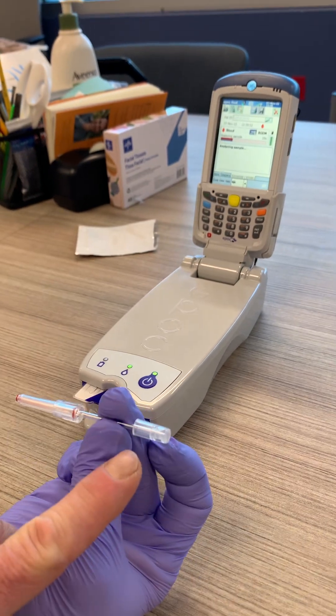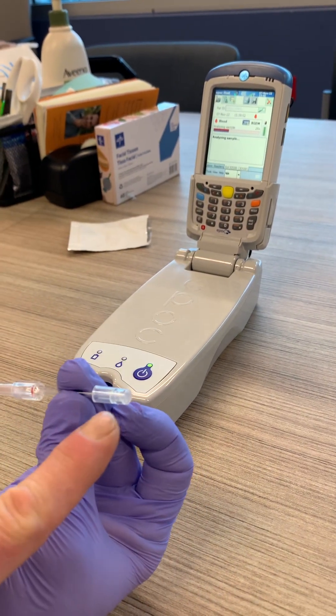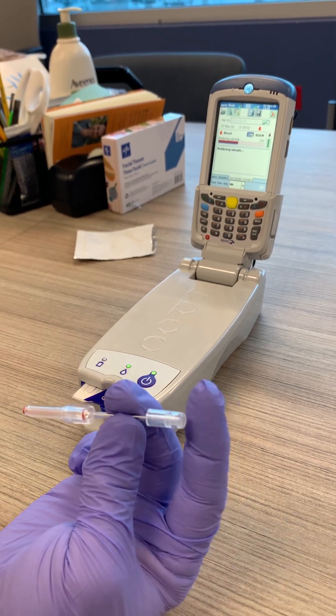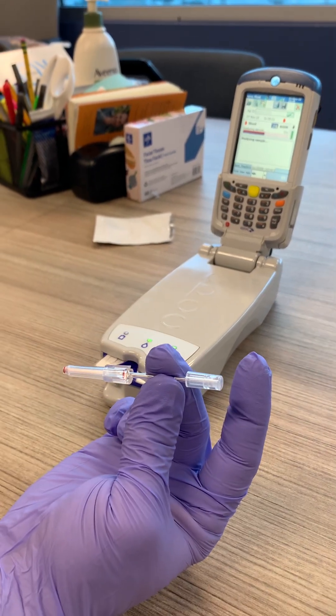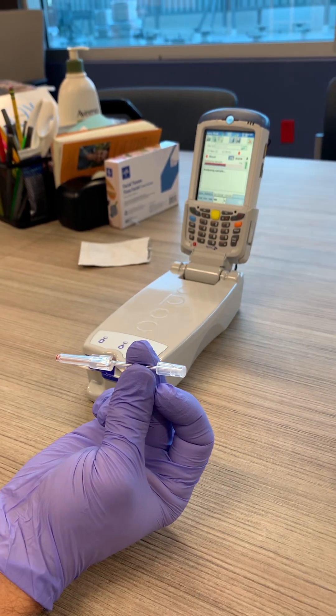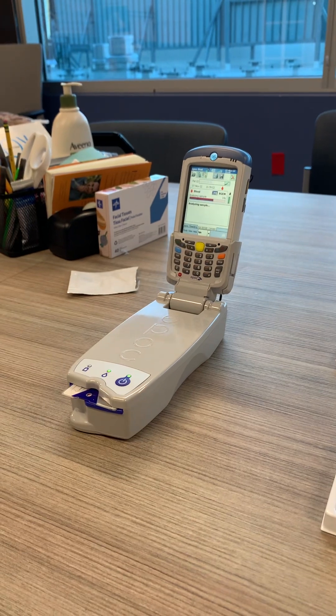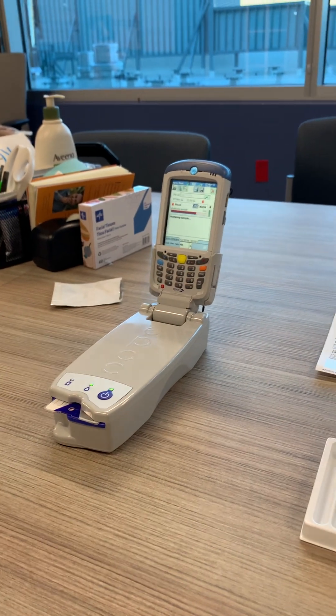If you look at the plunger here, you can see it has now been depressed — it's now from here at the top. So now you know that you can no longer use this EPOC capillary tube. And that should be it. Now you're going to take a look at it.